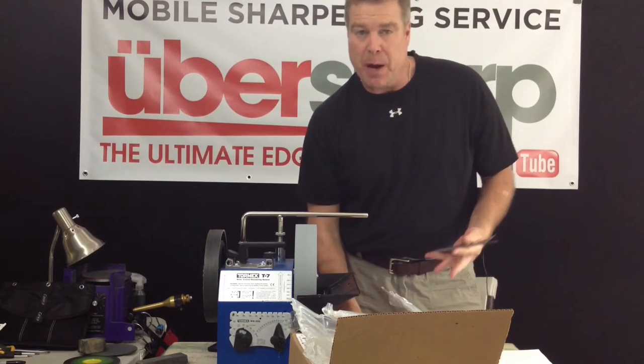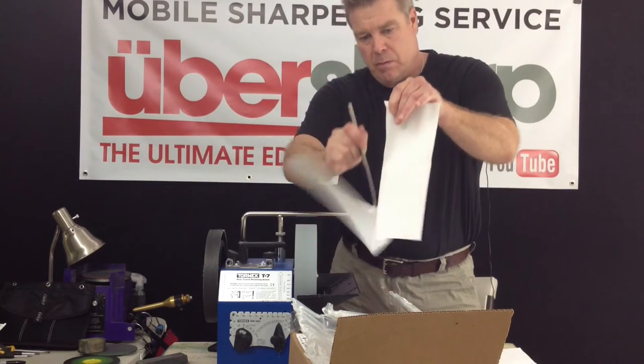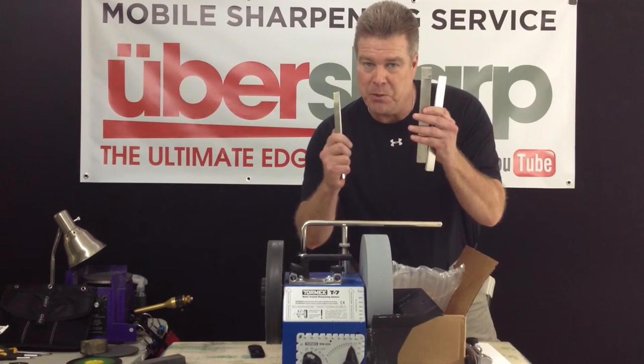Before I ship them off, I want to do a paper test to make sure they're ubersharp. Nice. These are the chisels I want working on my bones — no jackhammering with an ubersharp chisel.